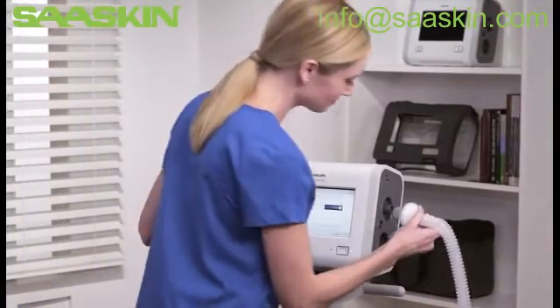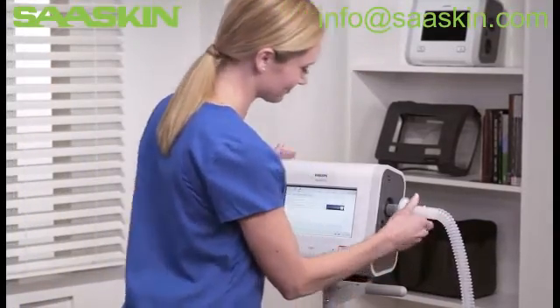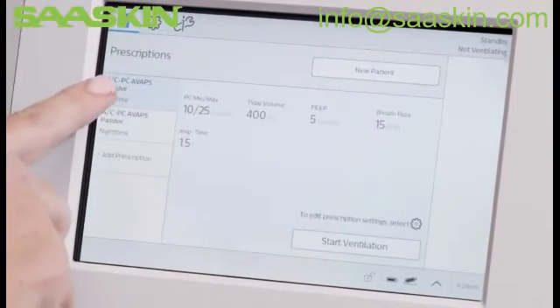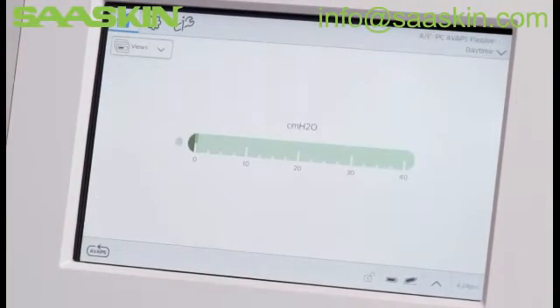To start ventilation using the daytime prescription, be sure to have a circuit in place. Press Home, Daytime Prescription, and then tap Start Ventilation.